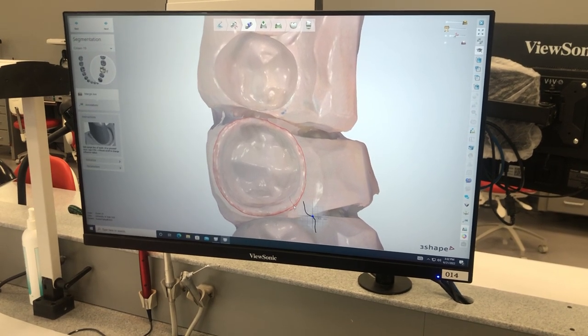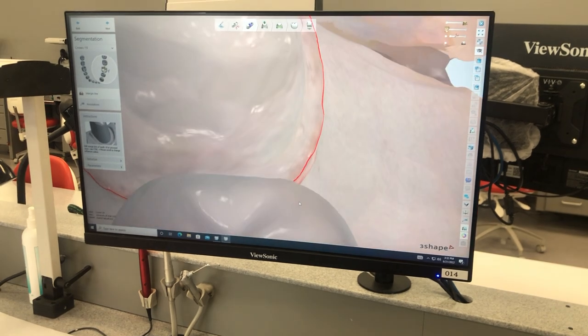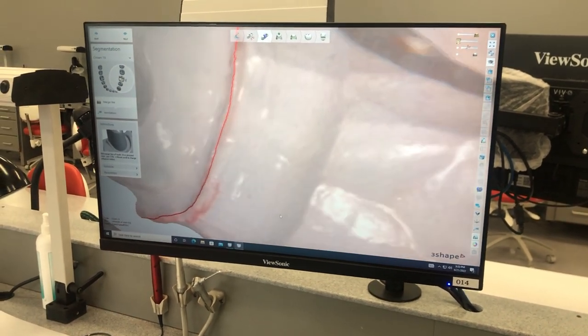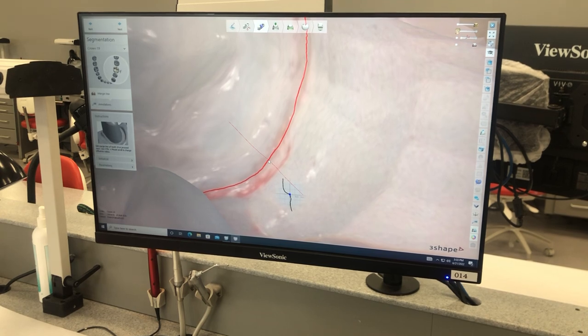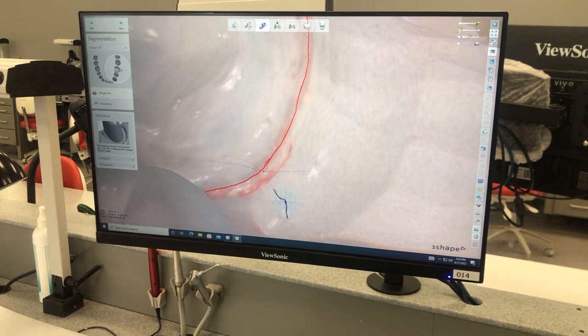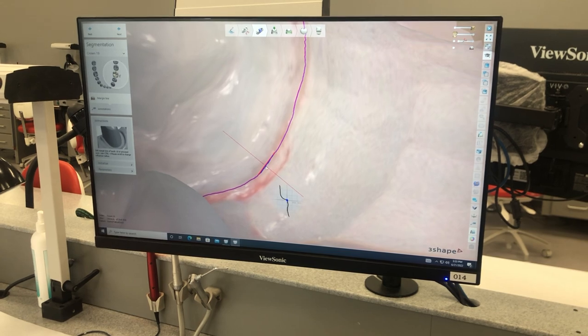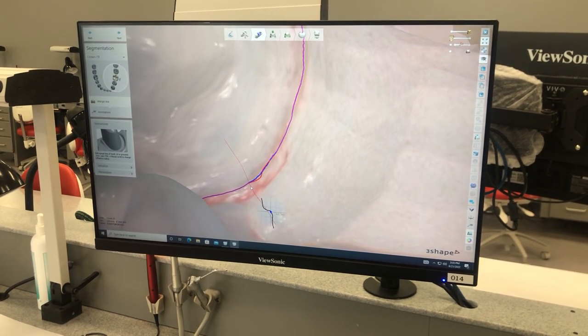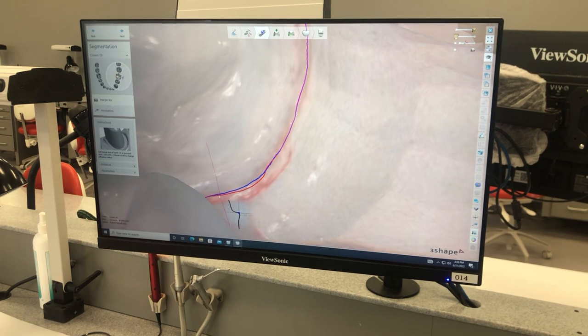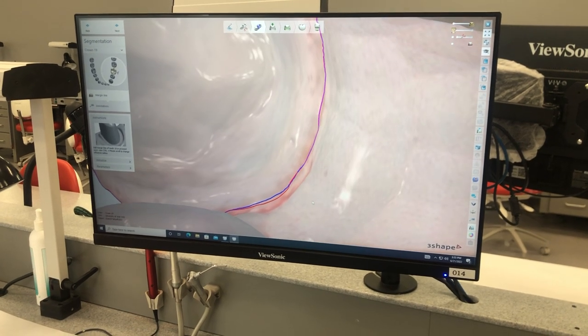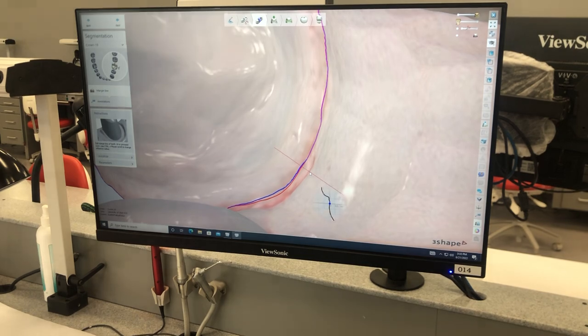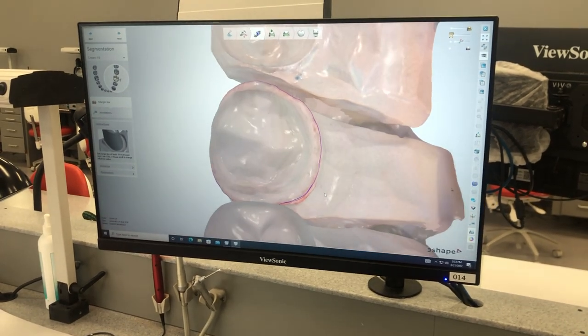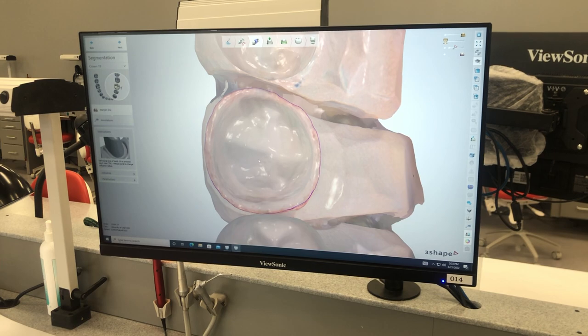So to change that margin, you can just drag that margin along. You can double click and then add dots and change whatever you need to in it to put your margin where you want it. Once you're done, you click next.